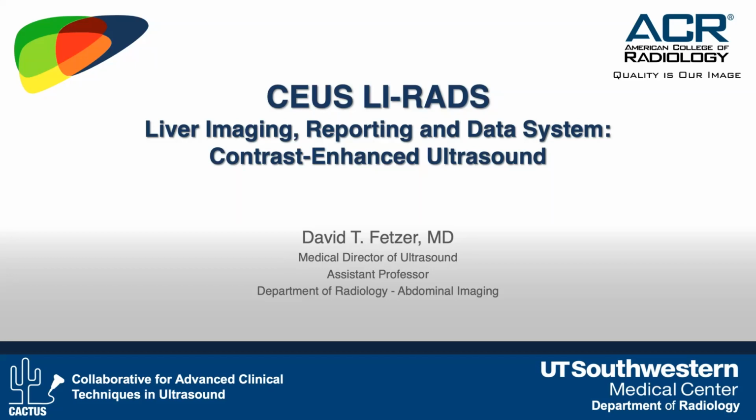So I'm sure many on the call, such as those from China, India, Italy, and so forth, may find a lot of what we'll talk about today as trivial. We have some folks here on the call who don't know as much about contrast enhanced ultrasound, and I may be able to enlighten them. And those of you who may know more, please don't pull the curtain away and reveal that I may not know nearly as much as all of you.